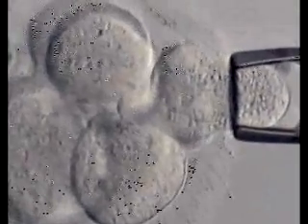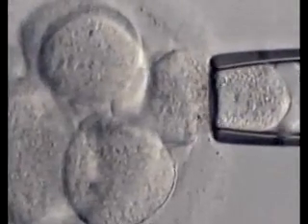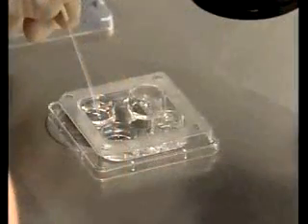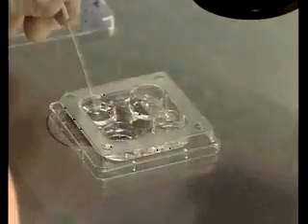Once the biopsy has been performed, the embryo is returned to the laboratory incubator, where it will be kept in an in vitro culture medium under adequate environmental conditions and allowed to continue its development until it is due to be transferred to the patient's uterus.